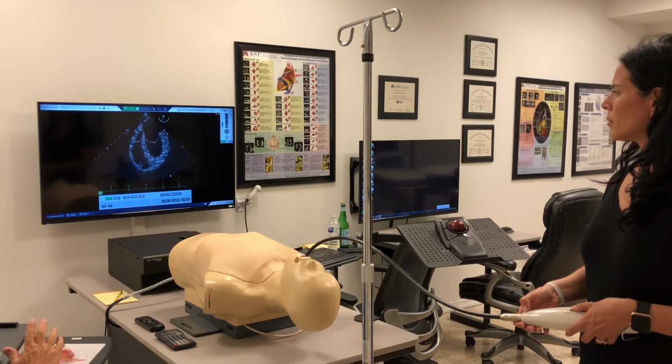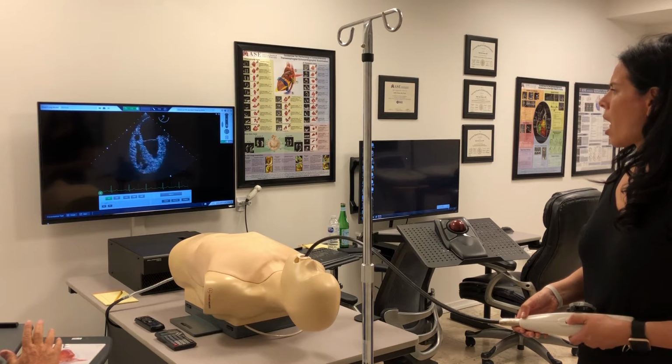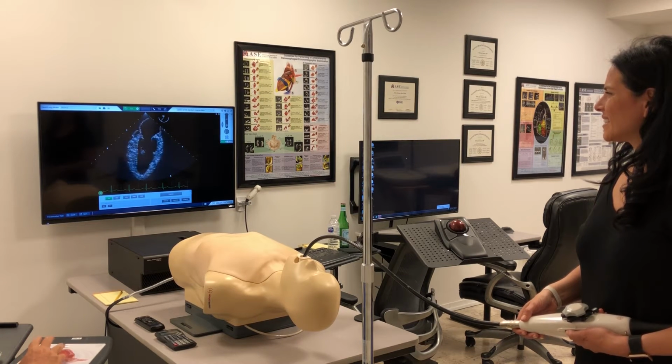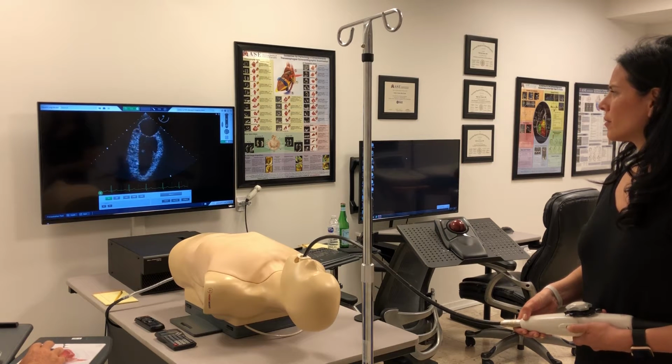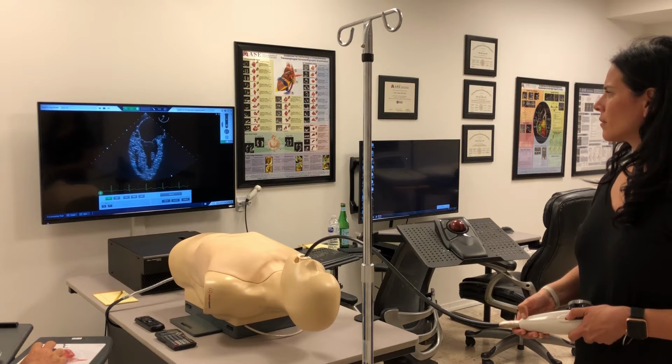Now you've turned a little bit clockwise, so these actually are all A's. This is A1, A2, and A3. But you'll find if you turn the other way towards the left lung, there, these are all the P's. Good. And let's go ahead back to the true commissure view where you're seeing the A2 scallop with the P1 and P3 on either side.